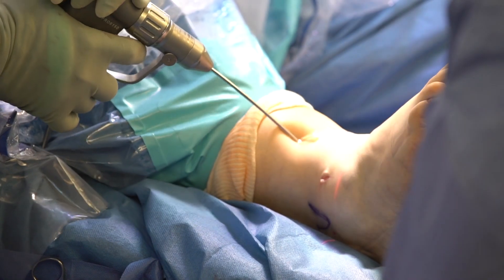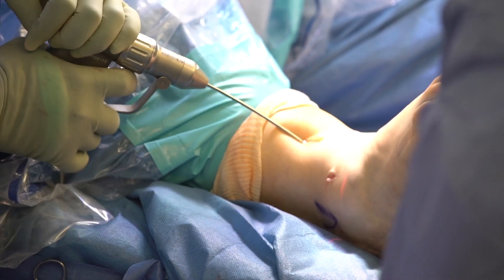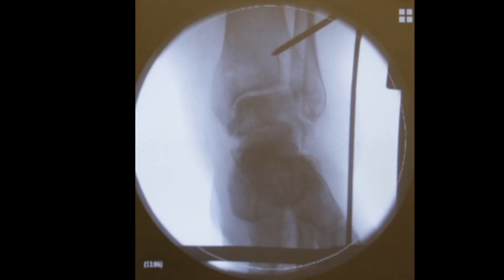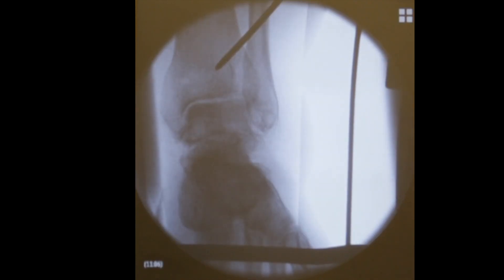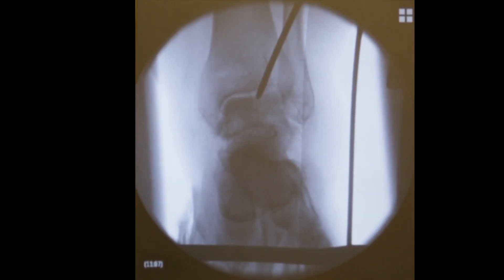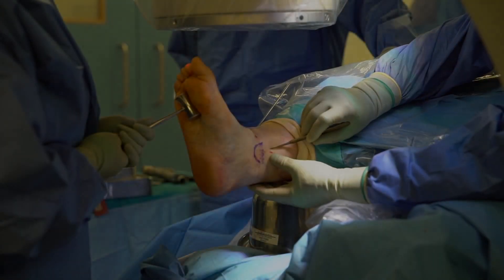Because of the varus deformity, the first screw portal is placed laterally so it can bring the foot into slight valgus. A guide wire is inserted under image intensifier guidance throughout the procedure. The initial position is adjusted and confirmed to be centered.